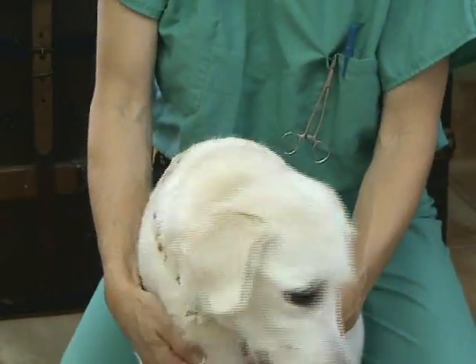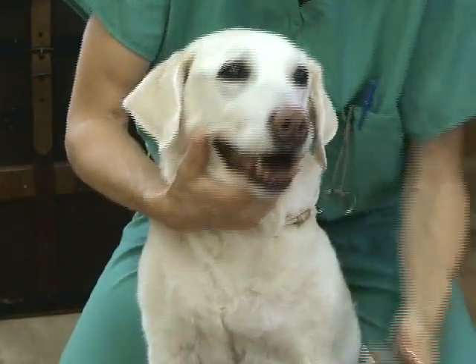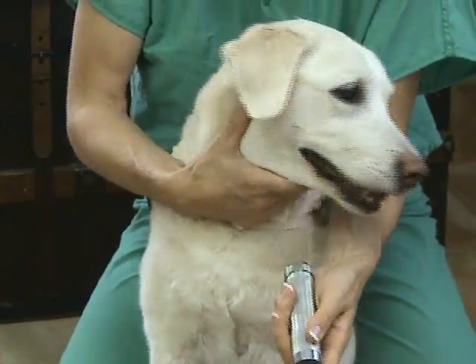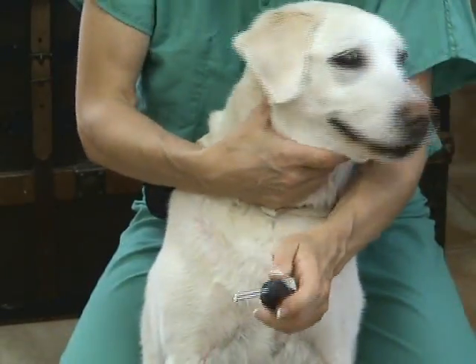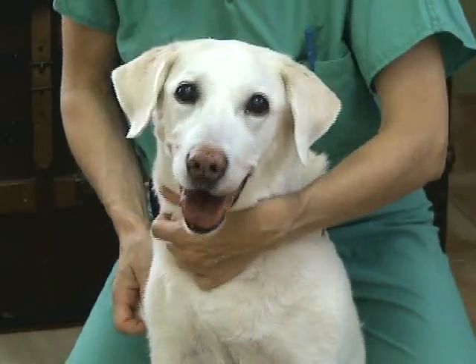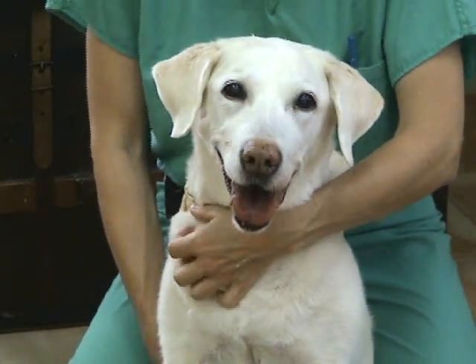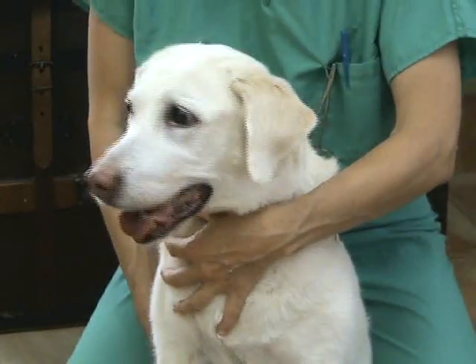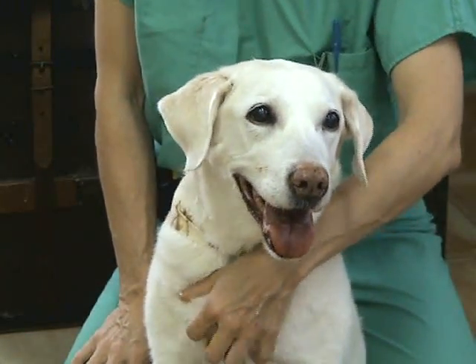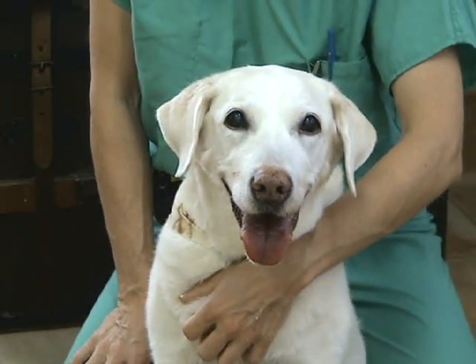The next test is vision, which can be assessed in a number of ways. The more familiar way is with the transilluminator, where you shine a very bright light — not a pen light, but a transilluminator — in the eye under a dim light setting to assess the pupillary light response (PLR). If the PLR is normal on both sides, you do not need to test indirect. You need to make sure direct is normal; if the direct PLR is not normal, then you need to assess indirect.